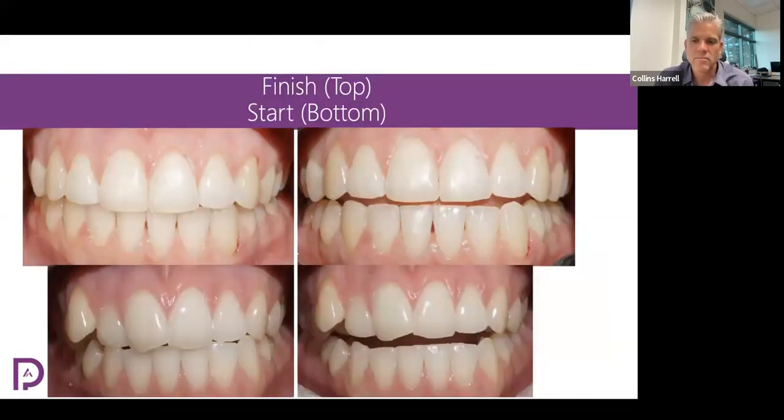Here you go with the photos. So here you can see, Dawn was pointing out this little black triangle down here, which for the patient to see that, they'd probably have to take their finger and pull their lip down to visualize it. So it's probably not as offensive. If you did some IPR right here to close that up, you could end up with a little bit of excess overjet. So you might end up having to do a little bit of IPR in the upper as well to also retract them a little bit to keep the overjet ideal.